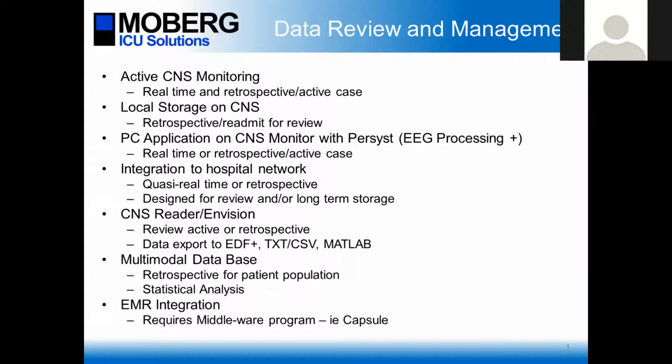Integration to the hospital network is a very valuable tool, and we talked about that a little bit. This is where you're really going to want to get your IT folks involved. This allows them to set up a shared drive, and an Ethernet cable would take the data from the CNS monitor to the network. It can be sent there in a variety of time periods. It can be sent incrementally, every few minutes, every few hours, whatever your hospital chooses.